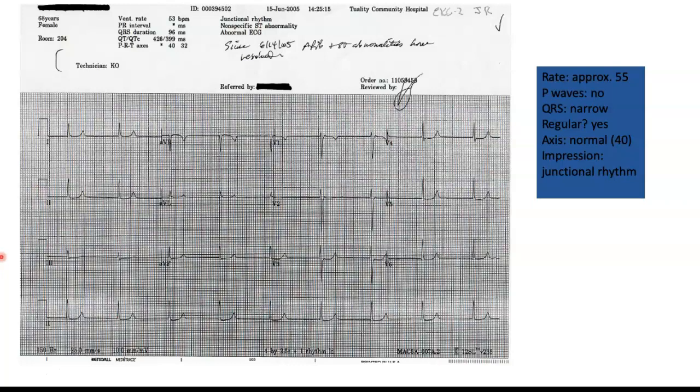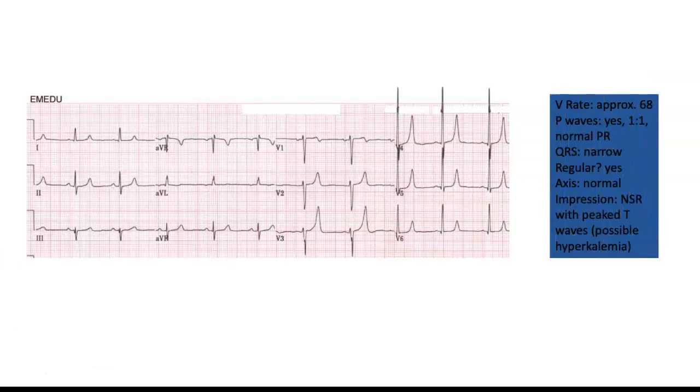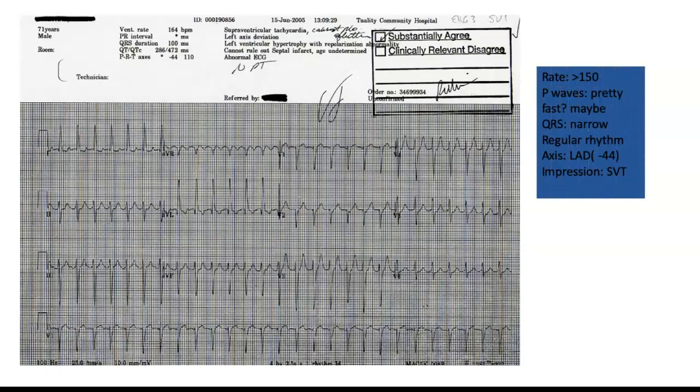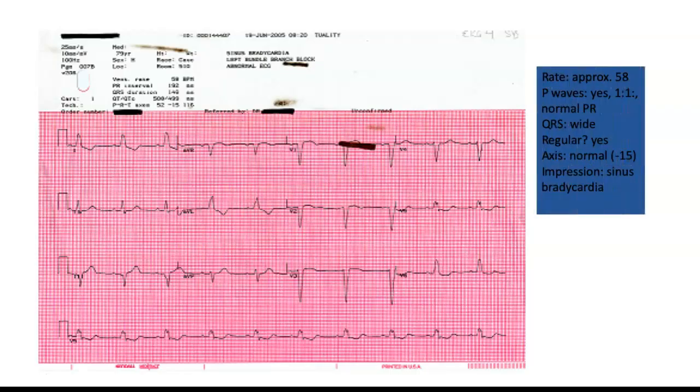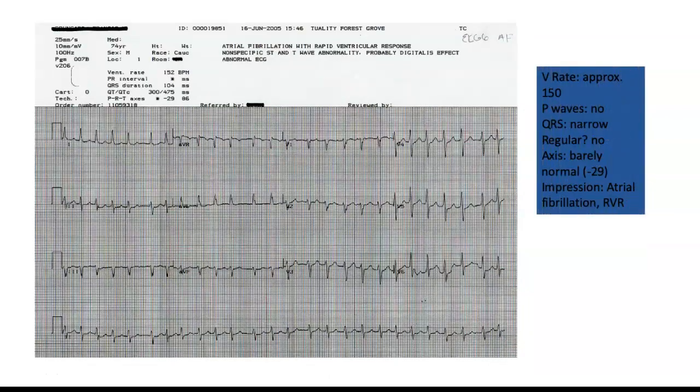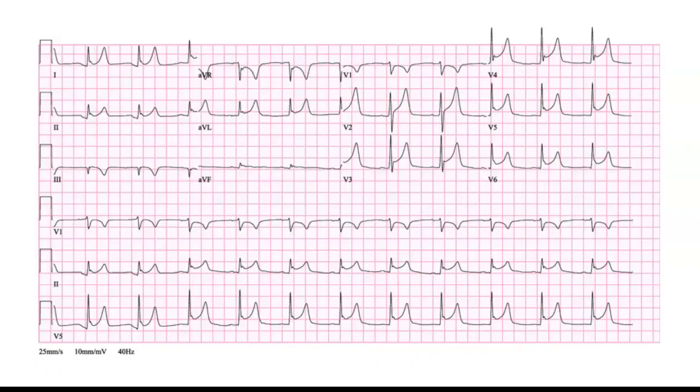I don't remember how many I put in here, but there are quite a few practice 12-lead EKGs, and not all of them show STEMIs, but many do. It can give you some practice with reading for arrhythmias as well as heart blocks and STEMIs.